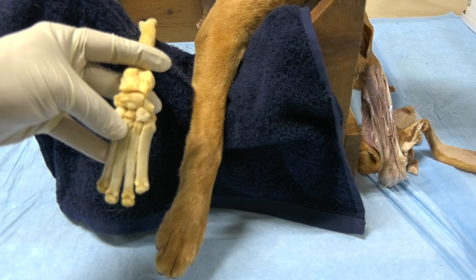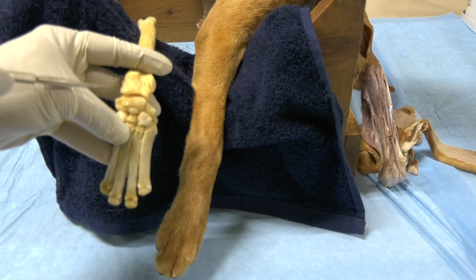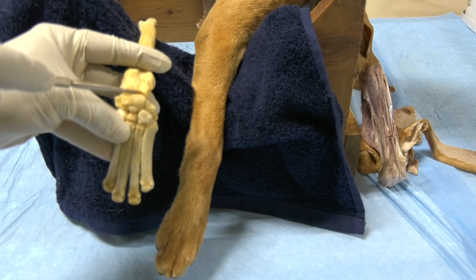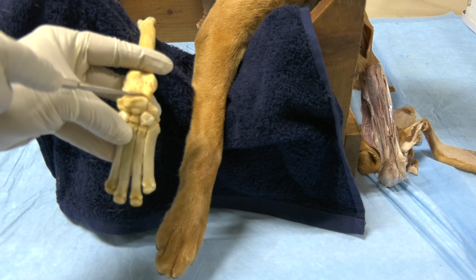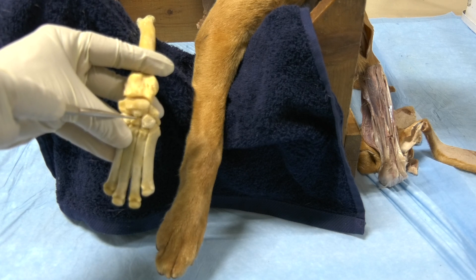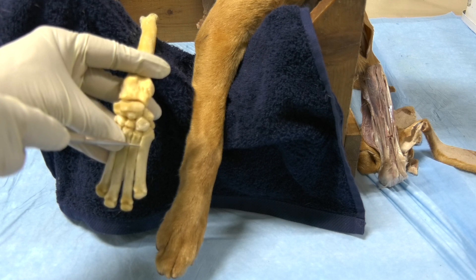When we come to the carpal joint, there are three levels of articulation, which means there are three joint cavities. The first articulation is the antebrachiocarpal, then we have the midcarpal, and then we have the carpometacarpal.